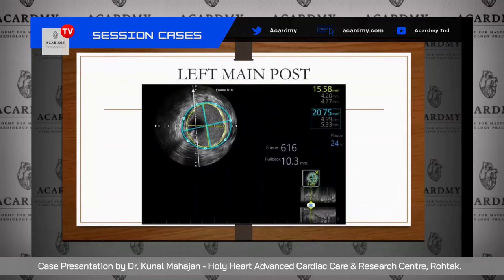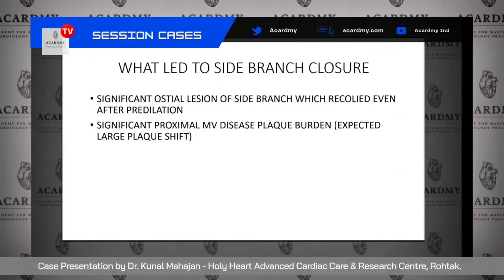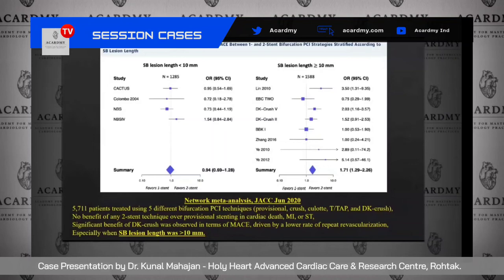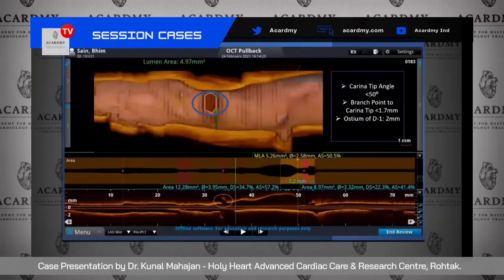The ostium area was 10.68 mm² and the left main area was 15.58 mm², reconfirmed on OCT. Regarding what led to the side branch closure: probably the large disease burden in the main vessel and significant recoil of the side branch. The reason I chose a single-stent strategy was that when side branch disease length is less than 10 mm, one-stent strategy is as good as two-stent. Unfortunately, it didn't work. A key OCT learning: you can predict side branch outcome using the carina tip angle — if less than 50°, and if the distance from the branch point to the carina tip is less than 1.7 mm, these are cases where you will likely lose the side branch after main vessel stenting. Both these criteria were fulfilled in my initial OCT run, but I was unaware of them at that moment.